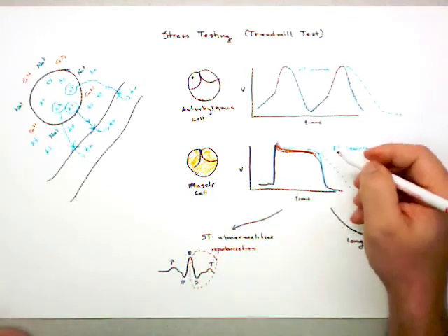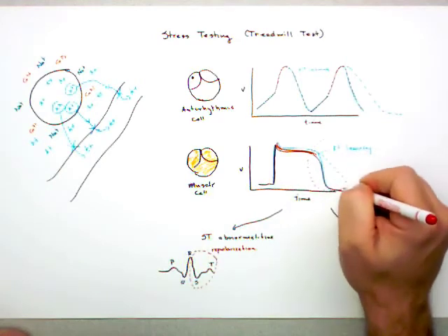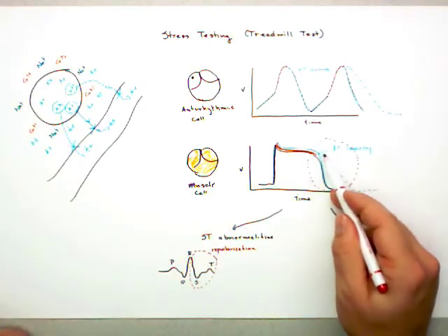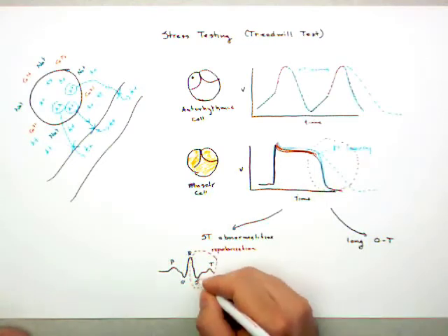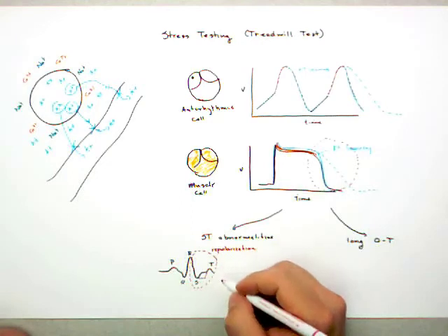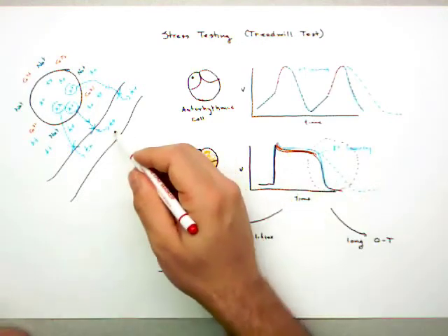If we look at our action potential, it's out here. Now it's not real predictable how this change in repolarization will affect this. It's just known that it will change. You'll change the ST signal. You might depress it. You might make it larger. In any case, it's going to change. And if it changes, it means this changes, and it means this changed.